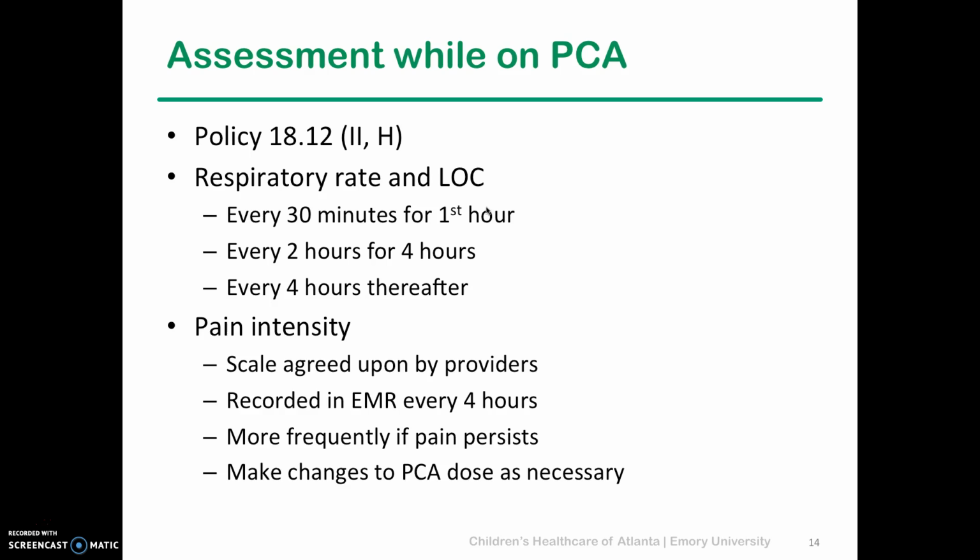With respect to the pain intensity, a scale needs to be used that is agreed upon by all providers of the department managing the patient. Pain needs to be recorded in the electronic medical record every 4 hours, more frequently if the pain persists. And then providers need to make changes to the PCA dose as necessary depending on these pain levels.